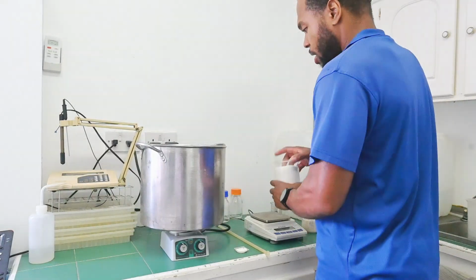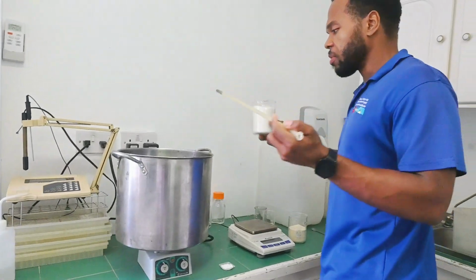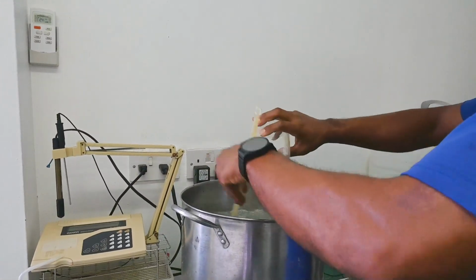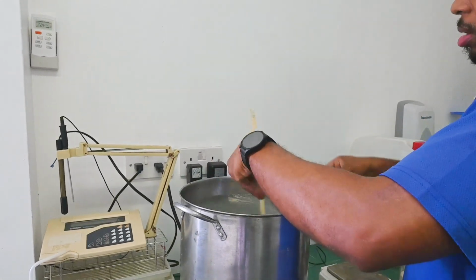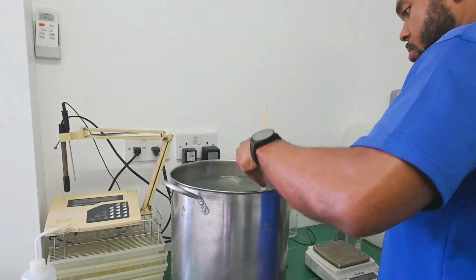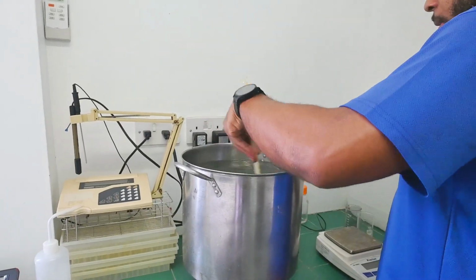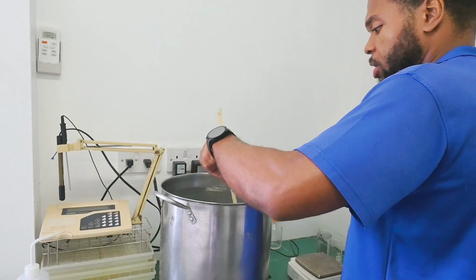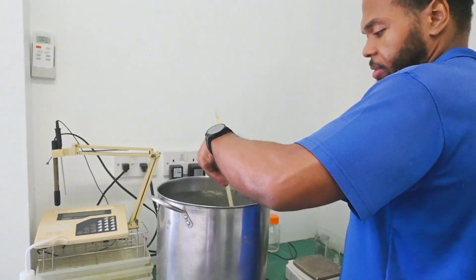So we're going to add all the dry ingredients to the pan with all the stock solutions and the water. We have to dissolve everything. We're going to start with the sugar. We're going to add everything. Dissolve the sugar. The next one we're going to add is the myo-inositol. One of the last things we're going to add is the gelling agent, the agar. But we first have to set up the pH meter to measure the alkalinity or the level of acid.